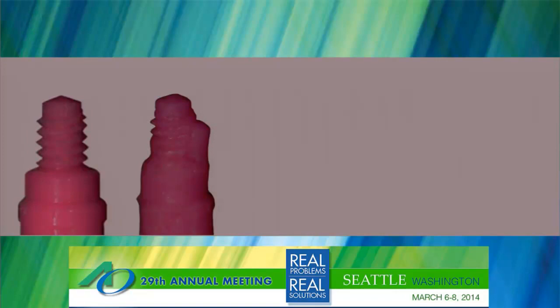So maybe a little bit easier to see, I took impressions along the way of the site. This first image is just an impression of an analog, and then you can see the impression of the implant after the screw fragment was taken out.